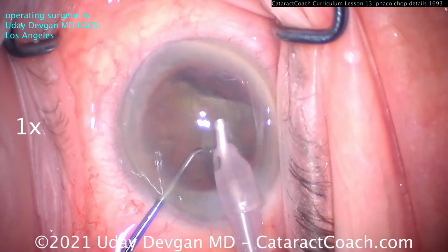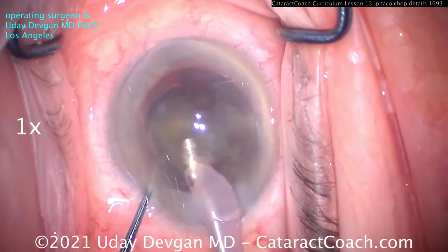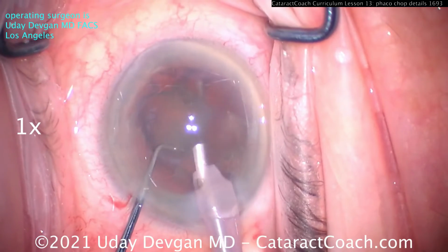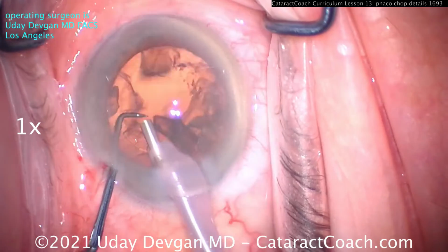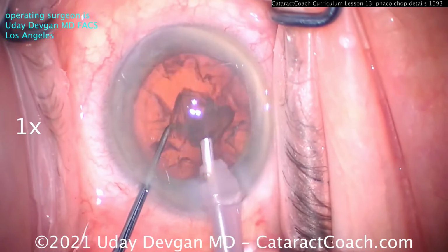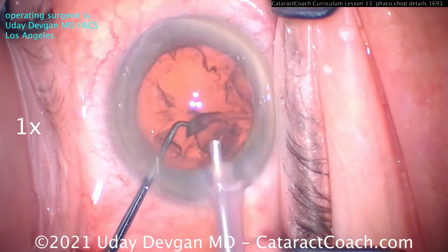So again, the Phaco parameters are going to be a high vacuum, 400 or 500 millimeters of mercury. The flow, I like about 40 cc's a minute, so things happen in a very efficient manner. And you need to have a sufficient infusion pressure. So if it's pressurized infusion, at least 75 millimeters of mercury during this portion. If you're doing just bottle height or gravity fed, at least 100 centimeters above patient eye level. And you can see the nucleus is removed in just a little bit more than a minute.